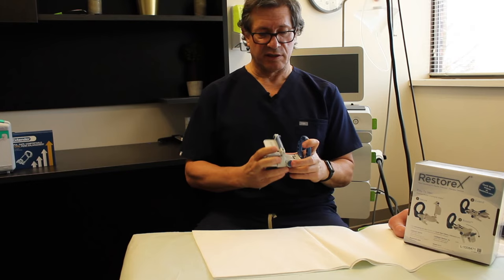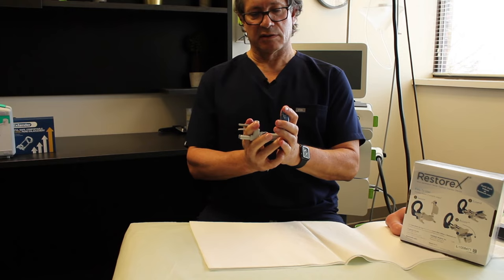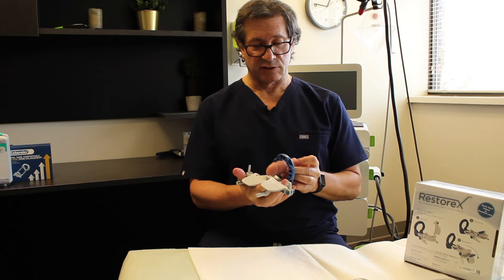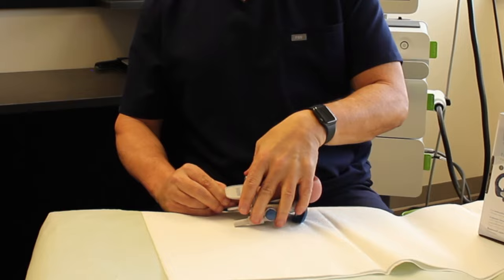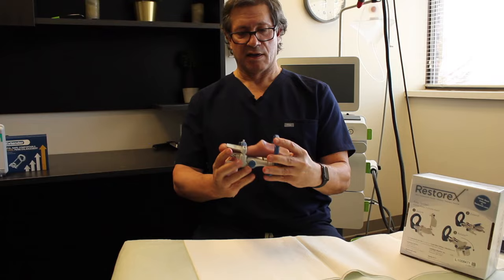You can even tilt the device up or down or side to side, and it has a locking mechanism on the springs that also allows for further extension. To apply it, you pass your penis through this foramen, stretch it out beyond the glands, then press this down until it locks, and then unlock the springs and allow it to stretch out.